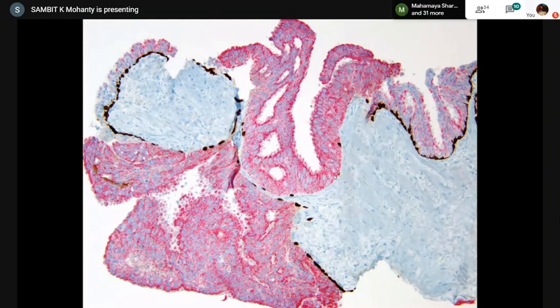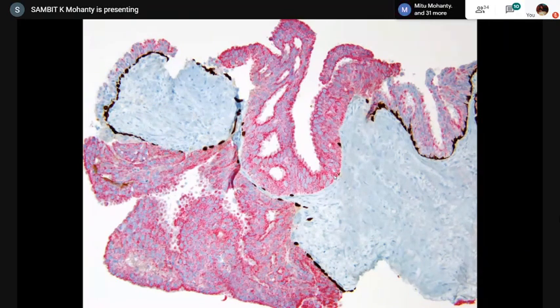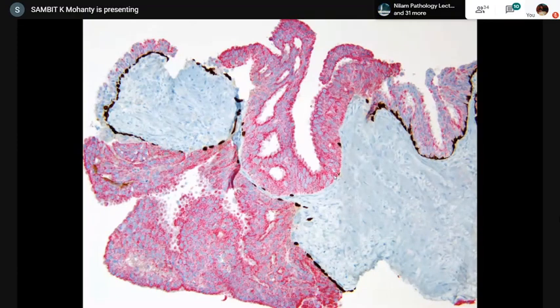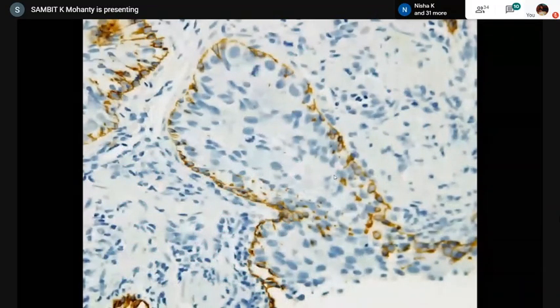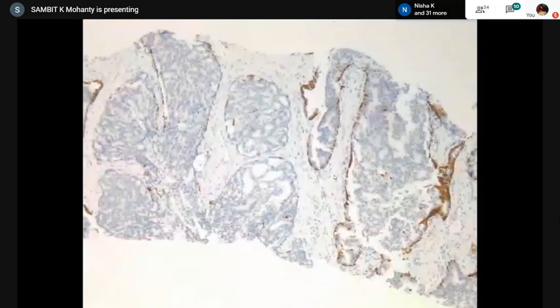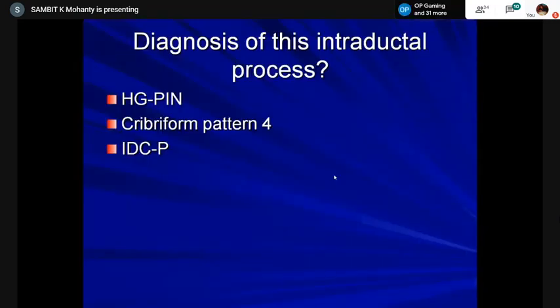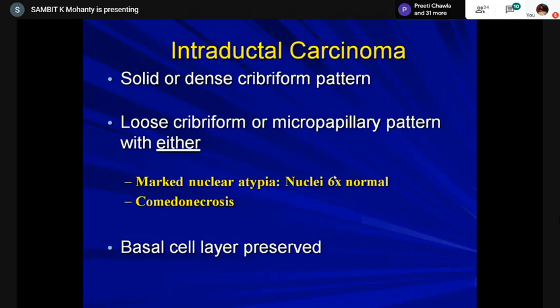I said traditionally because in injured cases — atrophic post-radiated settings — even normal glands can show wishy-washy racemase positivity. So when you see strong racemase positivity in the PIN4 cocktail, stay away from calling it non-neoplastic. I'm dealing with cancer, but it's a cancer where the basal cell is retained. My differential diagnosis was: am I dealing with high-grade PIN, or am I dealing with IDCP — intraductal carcinoma of the prostate? I finally signed it out as intraductal carcinoma of the prostate gland.